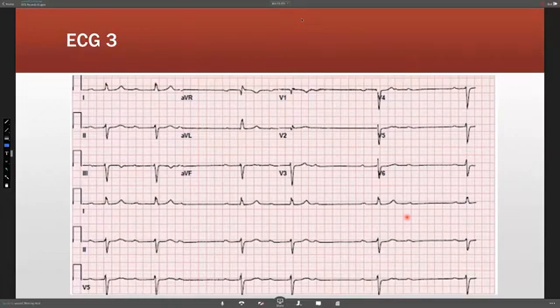When I've seen paroxysmal AV block, I've usually seen a transient complete heart block, given that it's not vasovagal, which I really need to rule out. Usually it happens in older patients who have some underlying bundle branch block or trifascicular block. I agree. Yousef, there is a question: post-aortic valve replacement, that happens several times. Yes, usually, but planting a pacemaker.